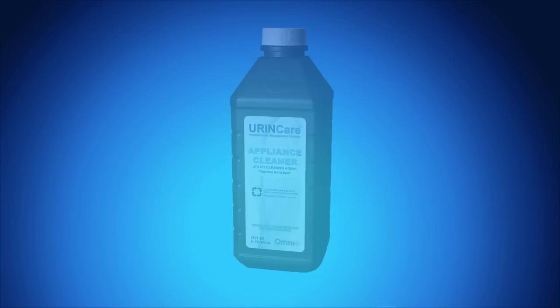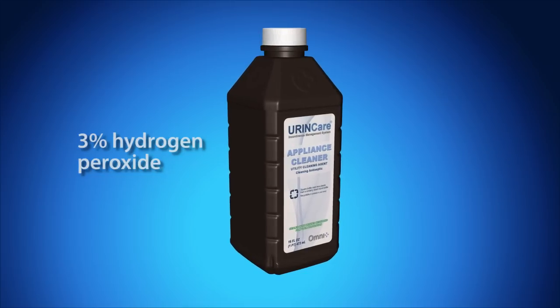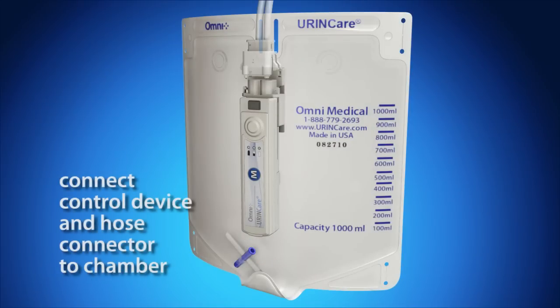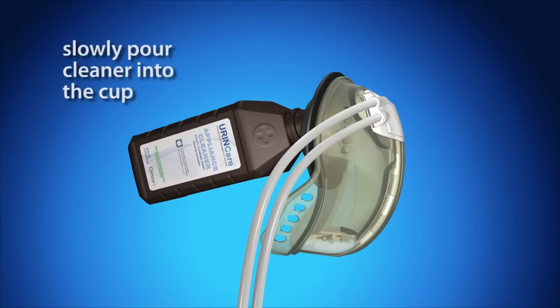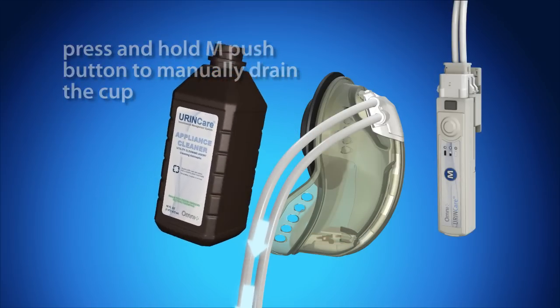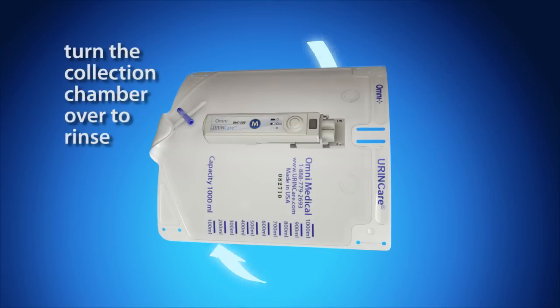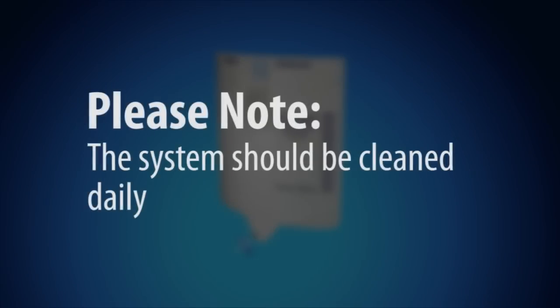Cleaning the system: For optimal results, the urine care system should be cleaned with 3% hydrogen peroxide solution, which can be purchased at most pharmacies. Do not use any other liquid cleaners or aerosol cleaners. Connect the control device to the collection chamber and male cup in preparation for cleaning. Do not wear the device while cleaning. Slowly pour the cleaning solution into the cup until the sensors are completely covered. Press and hold the M push button to manually operate the pump, draining the fluid from the cup. Run the system twice, then run a third time using lukewarm water. Once the cup is drained, turn the collection chamber over several times, allowing the cleaning solution to rinse out the inside of the chamber. When done, open the valve and drain the chamber. The system should be cleaned daily.